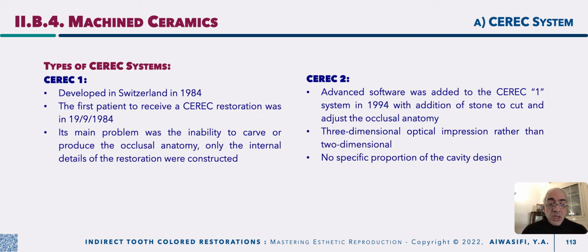Firstly, it was developed in Switzerland in 1984, and this prototype is called CEREC 1, where the first patient received a CEREC restoration on the 19th of September 1984. But the main problem was the inability to carve the occlusal anatomy at this time. We couldn't record the details of the cavity in 3 dimensions, and we couldn't record the opposing occlusion.